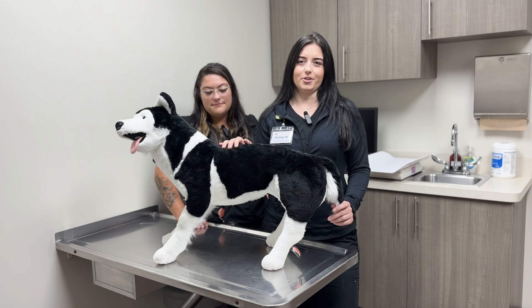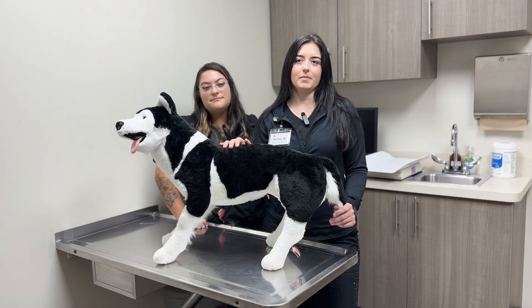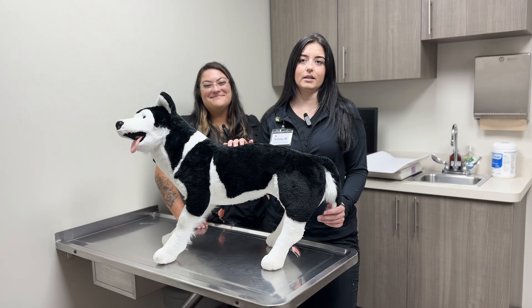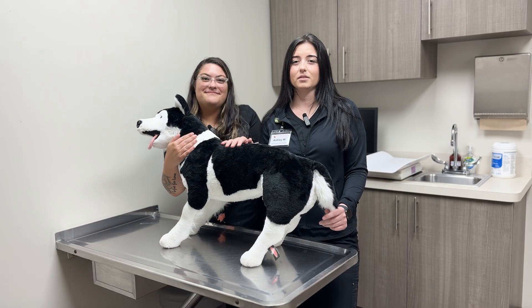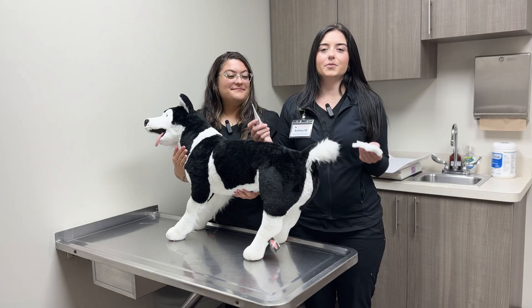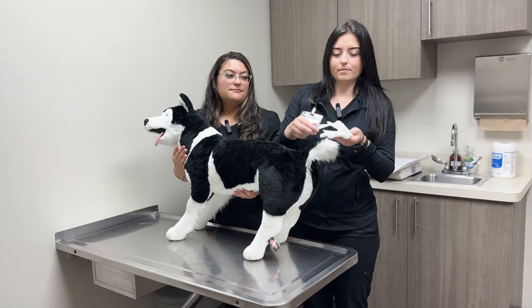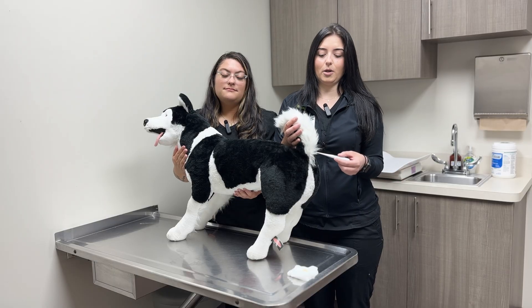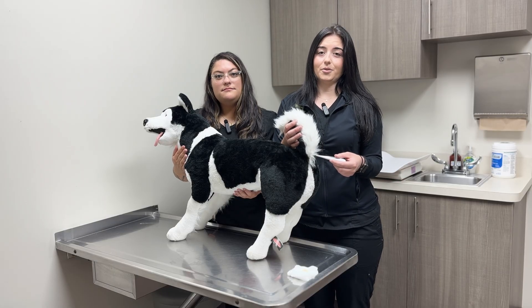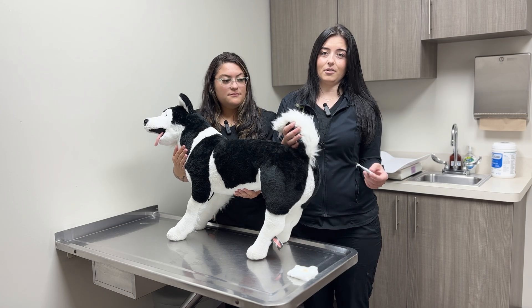Now let's move on to checking your pet's temperature. The most accurate method is using a flexible-tip baby thermometer or a pet-specific digital thermometer. It helps to have a second person gently hold and comfort your pet during the process. Apply a small amount of petroleum jelly or lubricant to the tip of the thermometer. Then gently lift your pet's tail and carefully insert the thermometer about one inch into the rectum. Hold it in place until it beeps, then gently remove it and sanitize using alcohol wipes.